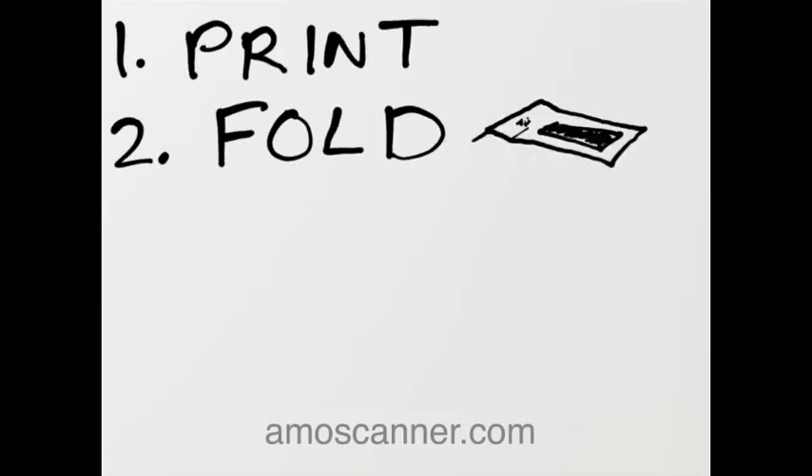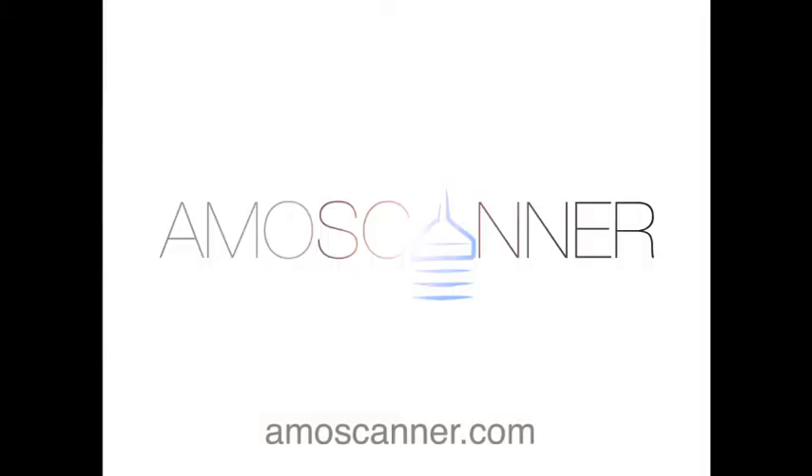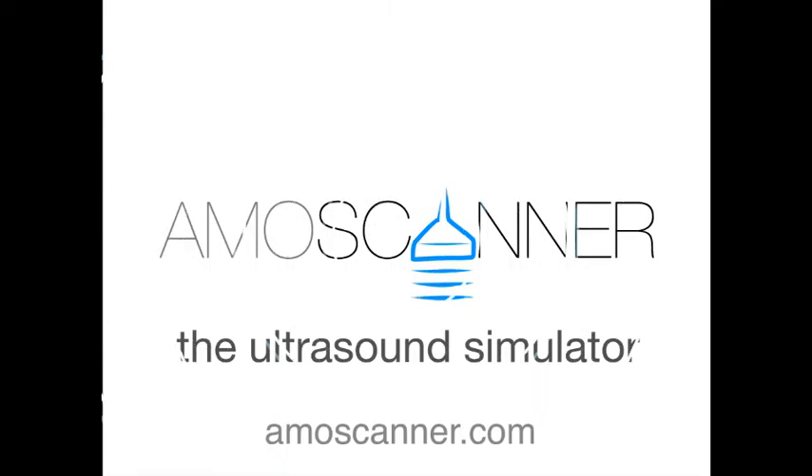So remember: print, fold and play. Amoscanner, the ultrasound simulator on your smartphone.